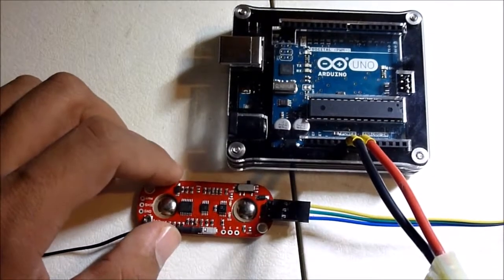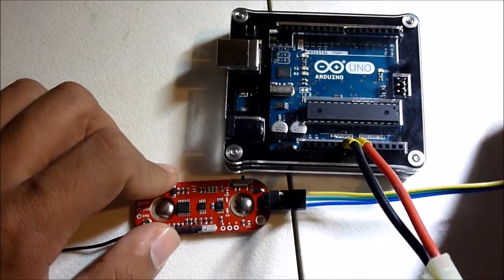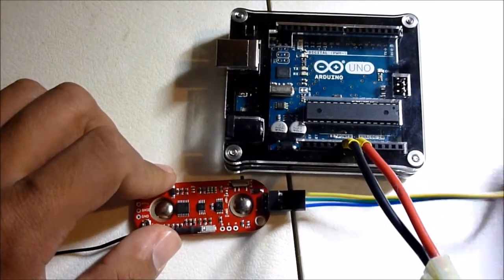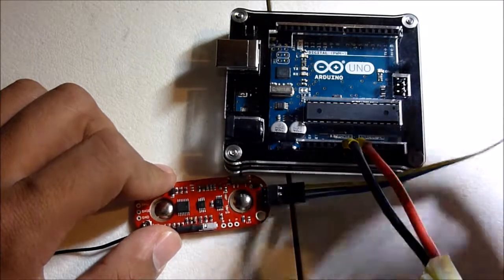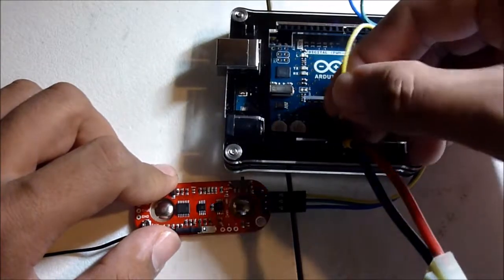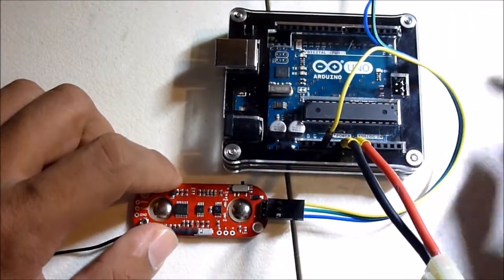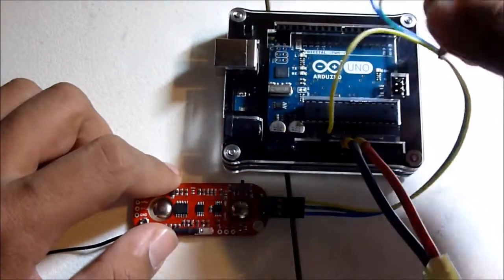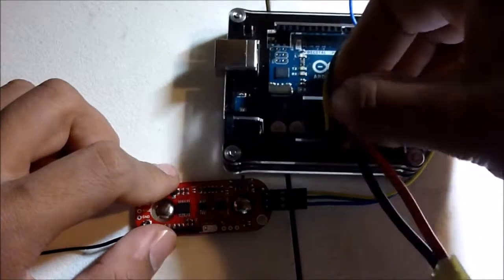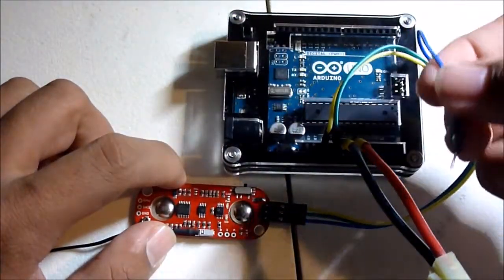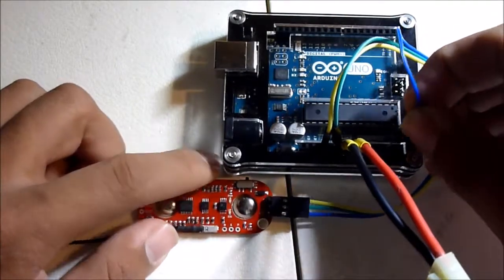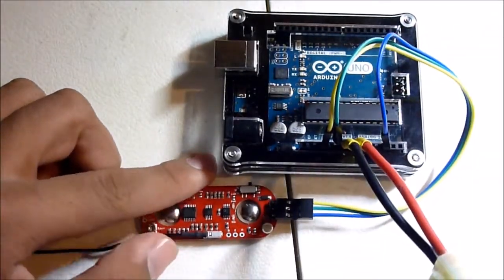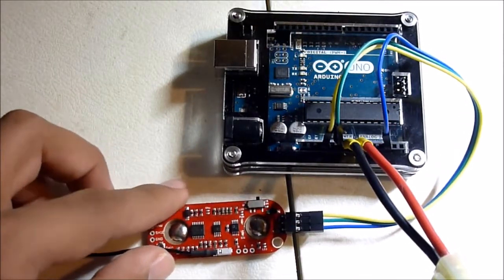Now, to attach the Myoware to the Arduino board, first, I'm going to get the positive lead and attach that to the 3.3V output on the Arduino board. Then, I'm going to get the negative lead and attach that to ground. And lastly, I'm going to attach the signal lead to the A3 port on the Arduino board. This is all we have to do to attach our Myoware to the Arduino board.